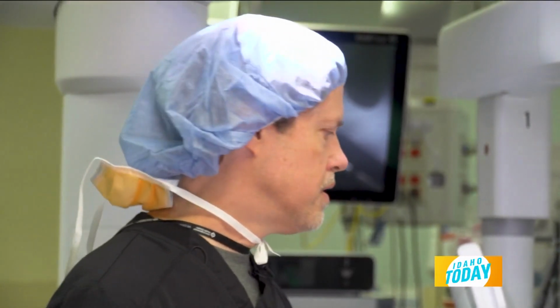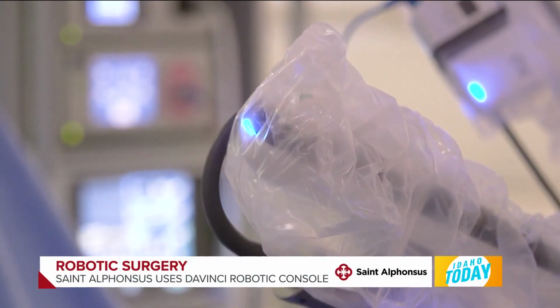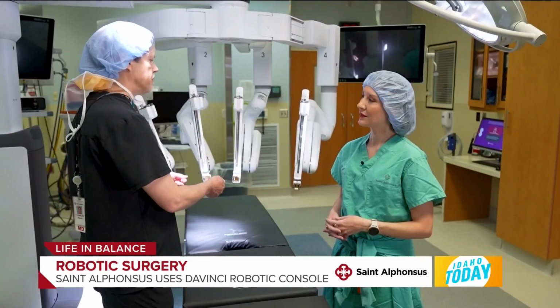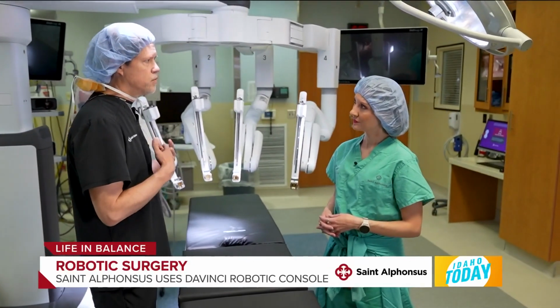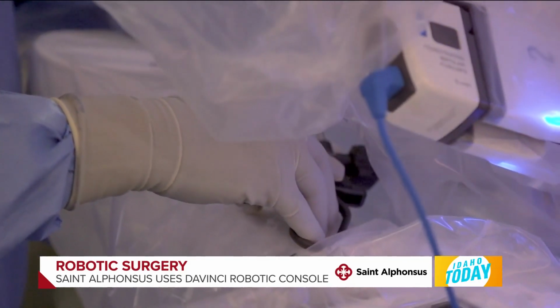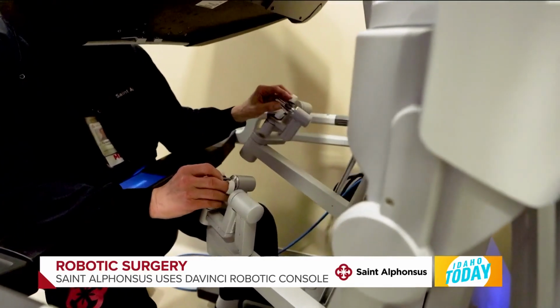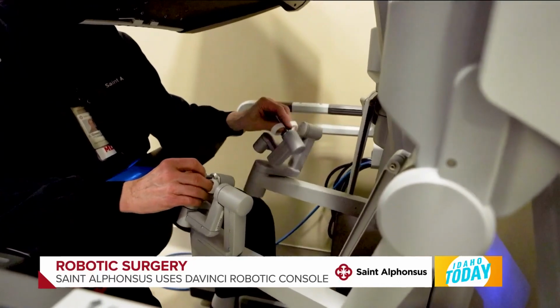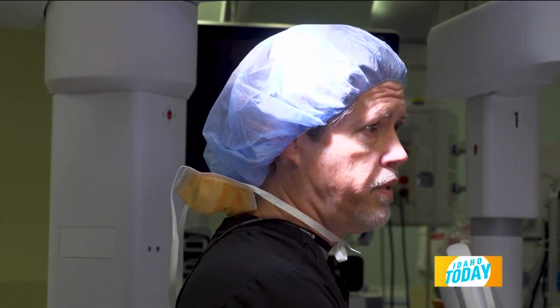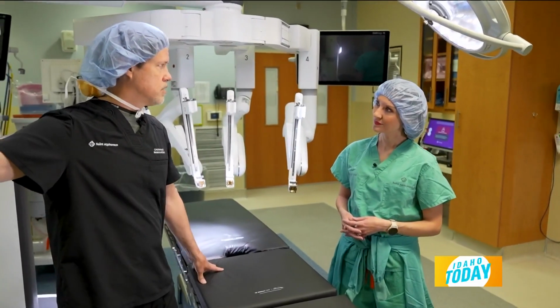So the way a patient experiences this, they come into the room, they're put asleep by anesthesia. Then our team helps prepare them for surgery, including prep and drape. And then the surgeon and the team get access to the abdomen or the chest or wherever the surgery is going to take place with small ports. These are like metal tubes. And through those tubes, they connect to the arms of the robot. And instruments go through these arms that are controlled by the console over in the corner, and that's where I sit to do the surgery. So the team is always by the patient, surgeons with the patient initially and at the end of the operation, but every movement of this device is controlled by the surgeon at the console.